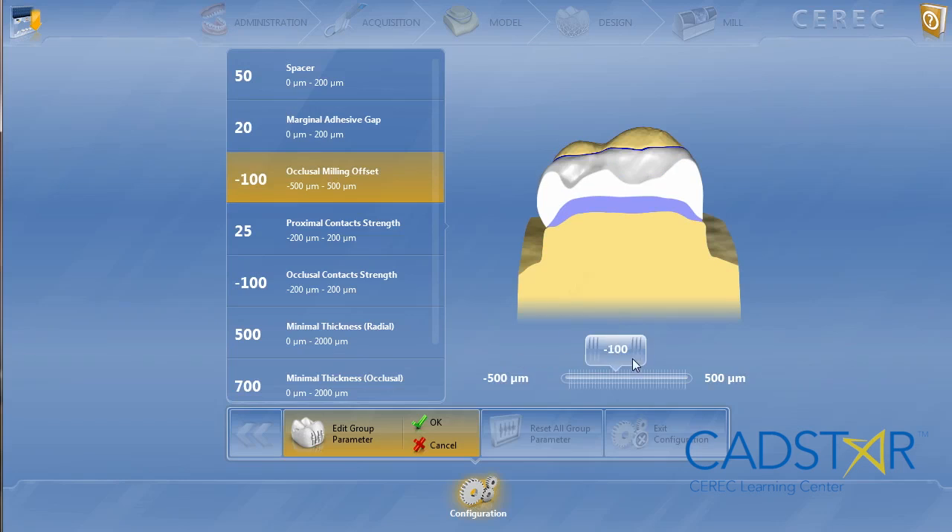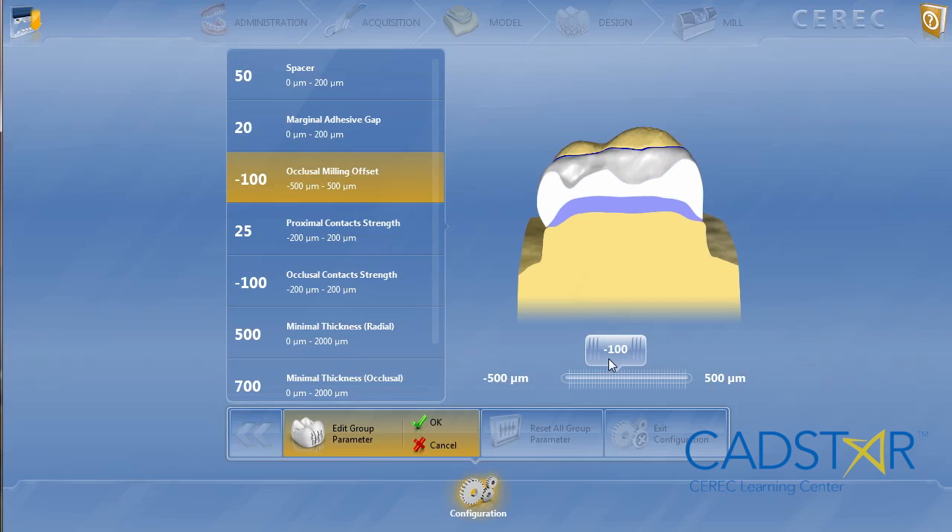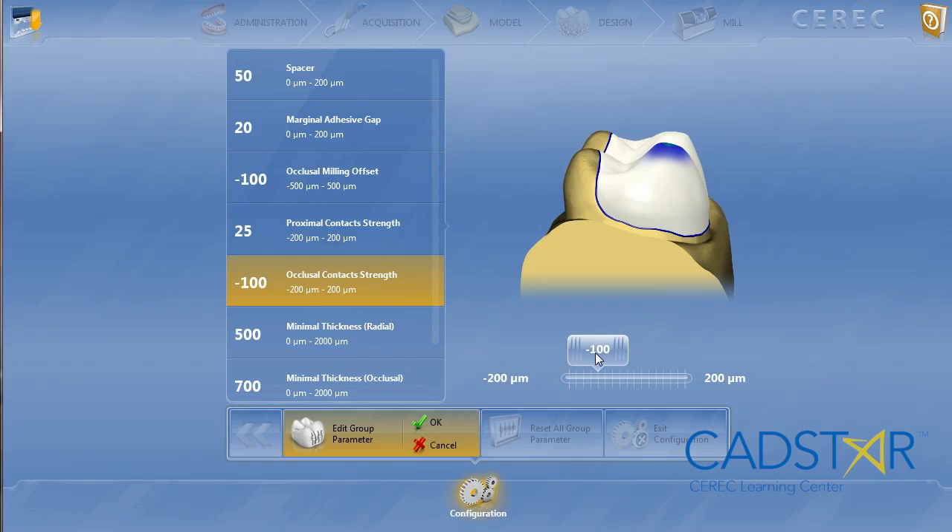Now on occlusion, there are two parameters: your occlusal offset and your occlusal contact strength. Occlusal offset: negative 100. Occlusal contact strength: negative 100.